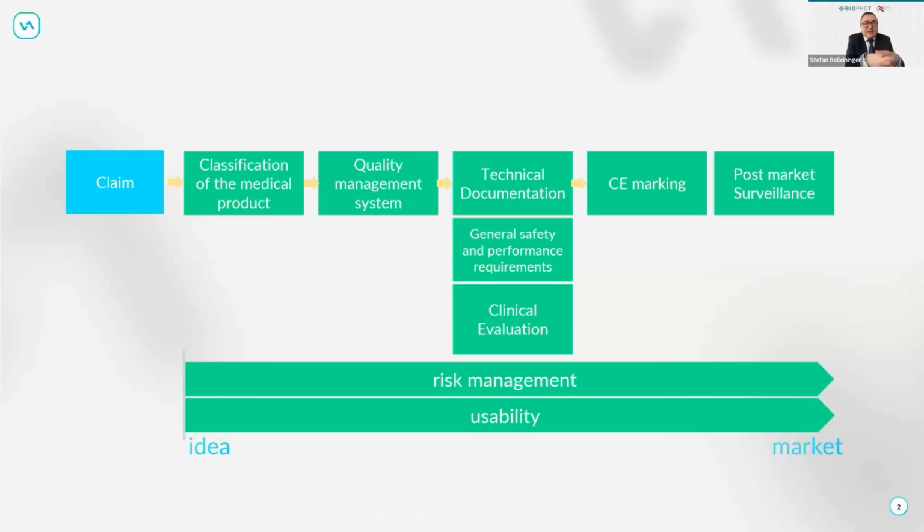It is still everything the same with a software as a medical device and also AI in a medical device or AI as a medical device. But that brings additional points where we need to go more into a standard way and also more into a documentation way than we have on other medical devices, like a physical one such as a syringe.